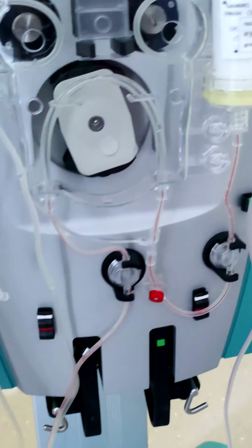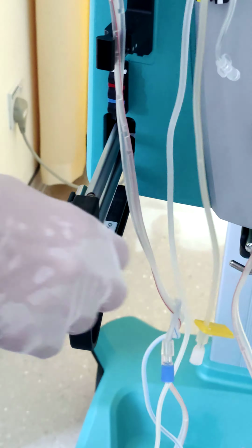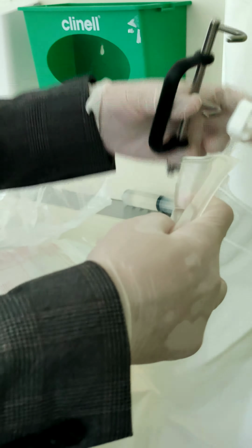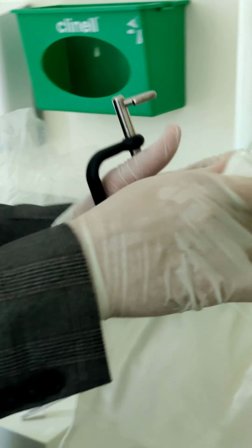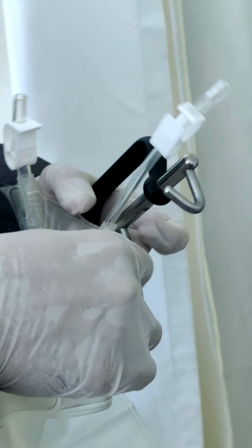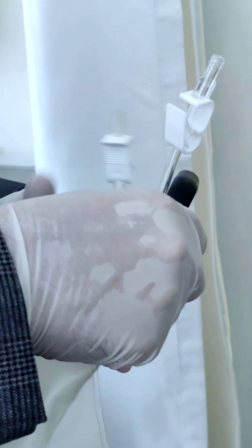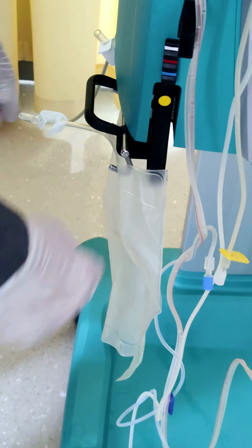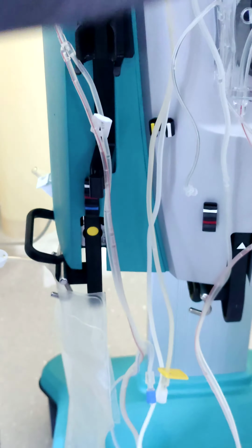Open the effluent scale, hang the collection effluent bag. Close this one, and we'll attach it here, and connect it here. Okay? And load. Before load, you have to make sure that there are no lines on the back.